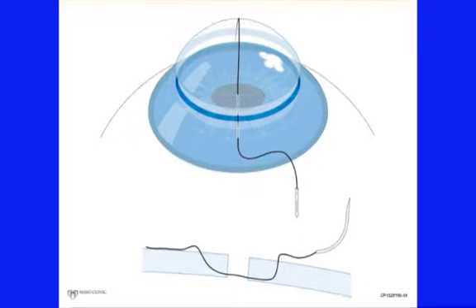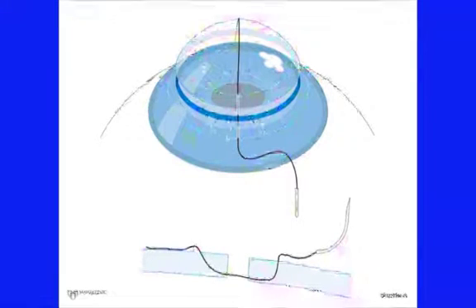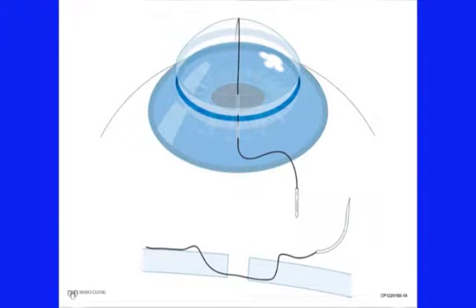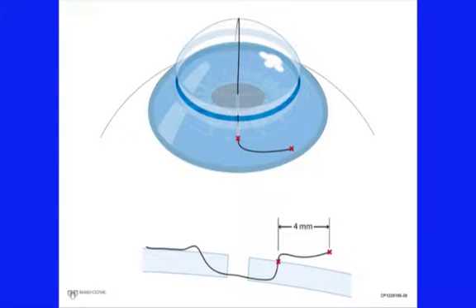As we pull the suture through the wound, we want the entire length of the suture to orient on the same plane as the suture that is passed through the cornea. We pull the needle side of the suture through on that line until the opposite end of the suture reaches the opposite corneal limbus. Then, we cut the suture about 4 millimeters from where it exits the host cornea. This maneuver gives the student the proper length of suture for tying.